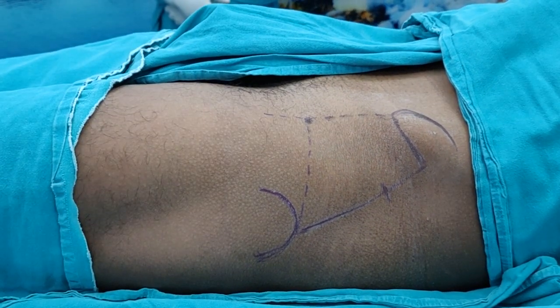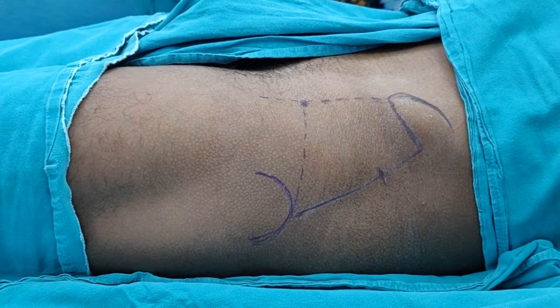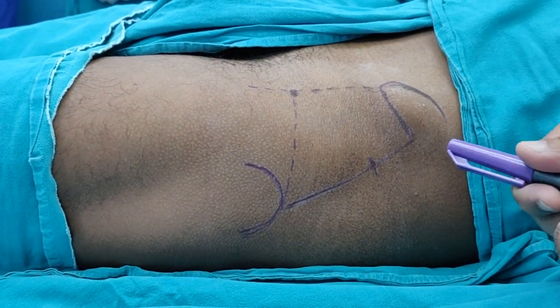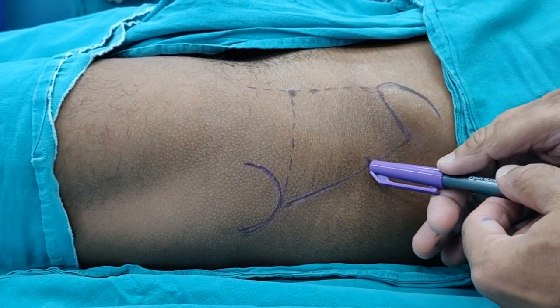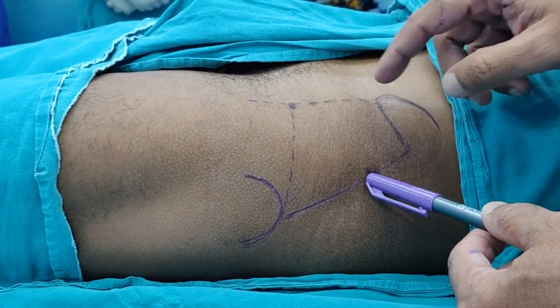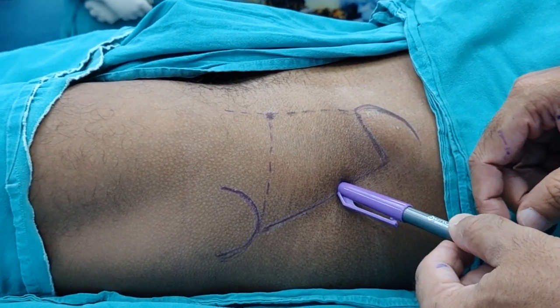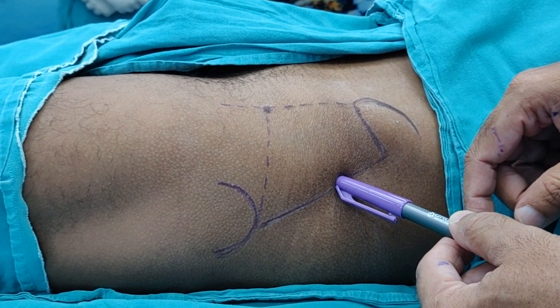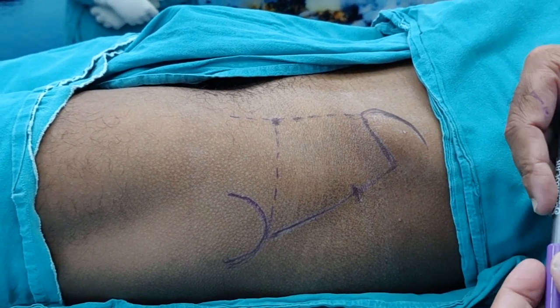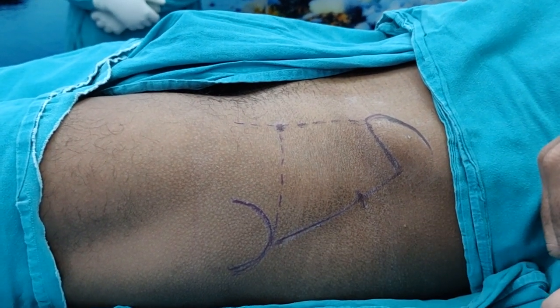The second technique uses this as our target — we are aiming for this point. If you are using a spinal needle, you start from the one-third and two-thirds junction and aim towards this target point, and you should hit the neck and inject. However, I prefer to go just from the top of the greater trochanter, and I will show you how I do it.